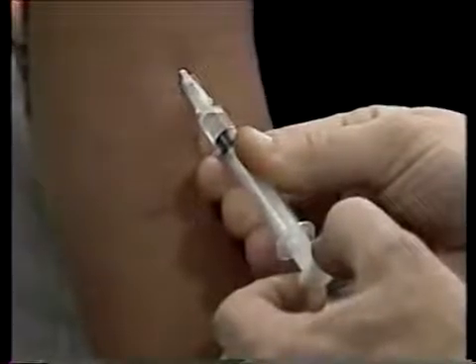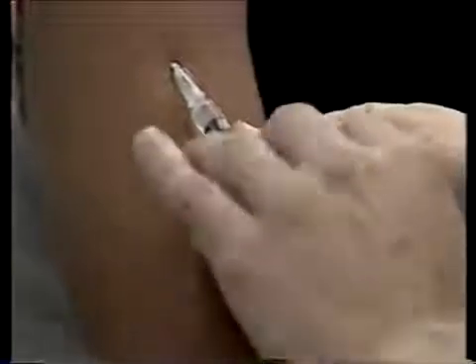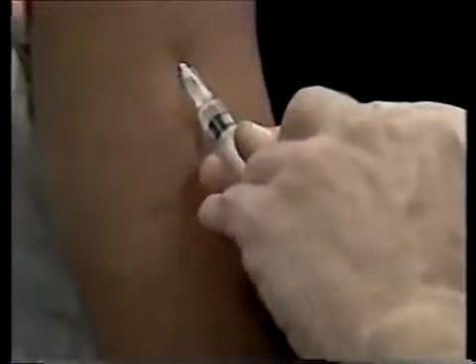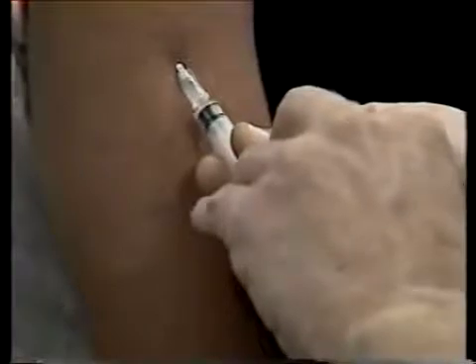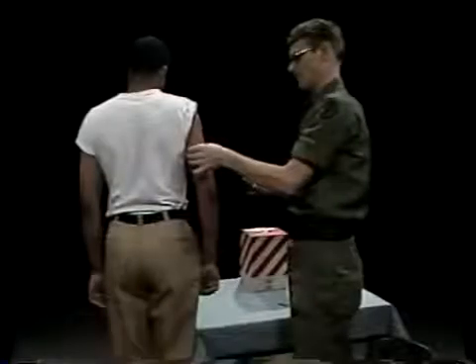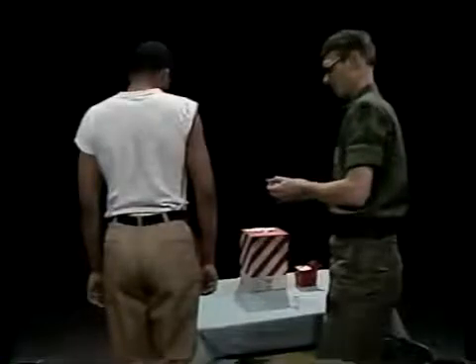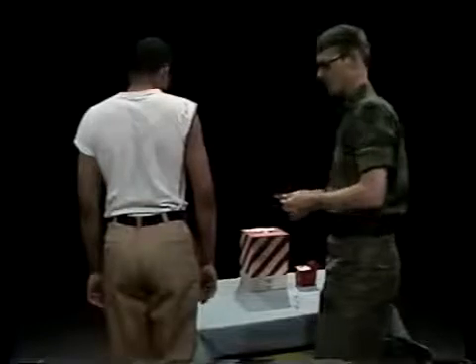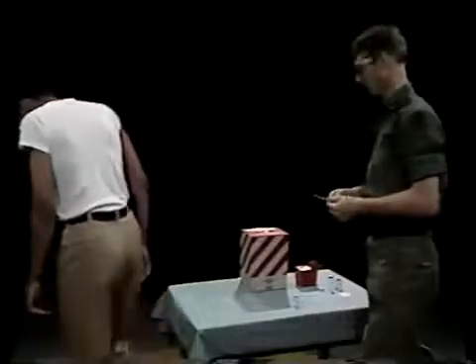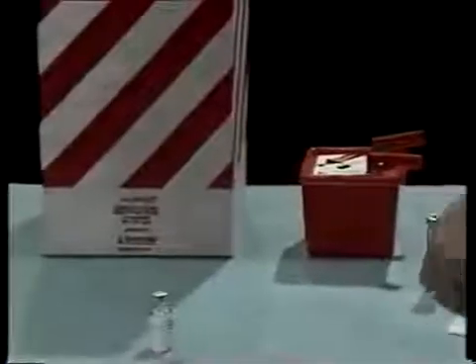If no blood appears in the syringe when you aspirate, press the plunger into the barrel slowly and steadily until all the medication is injected. Then put an alcohol sponge over the site and quickly remove the needle. Massage the site with the antiseptic sponge using a gentle circular motion to help disperse the medication throughout the tissue so that it will absorb readily. Then discard the syringe and needle in the appropriate container.